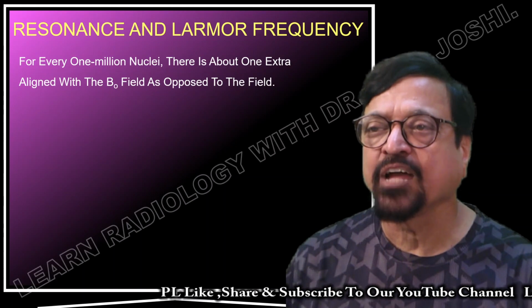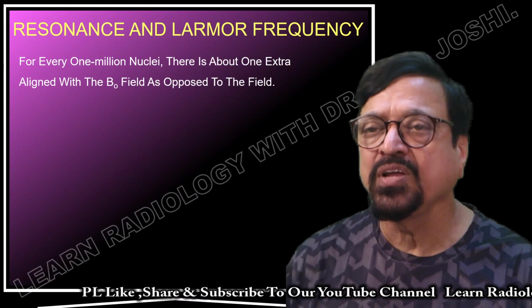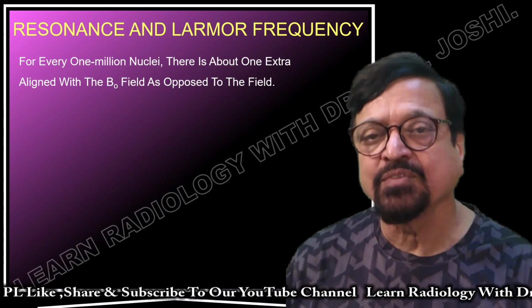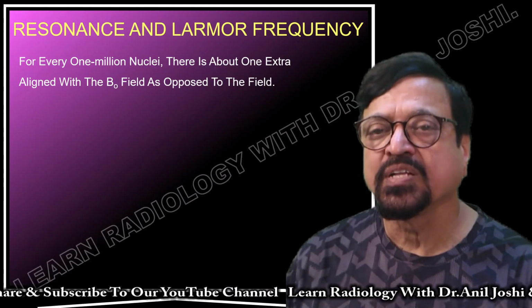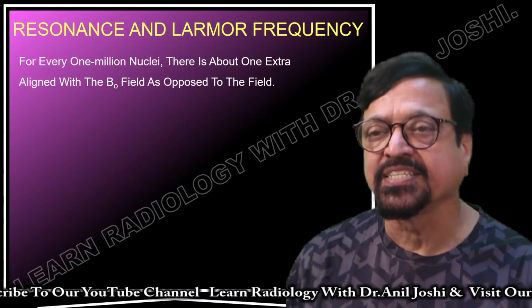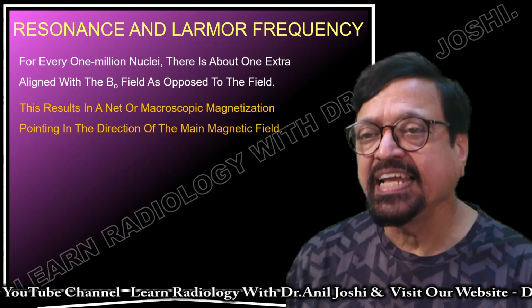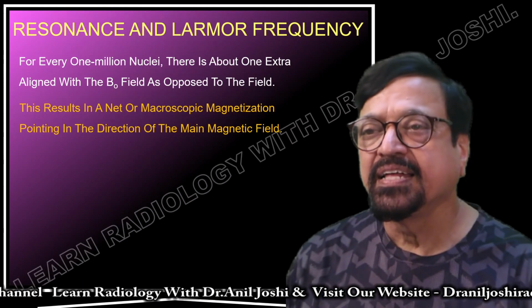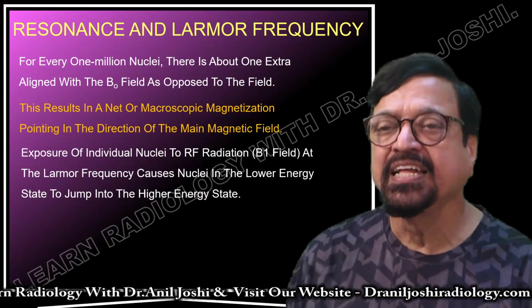Continuing resonance and Larmor frequency, for every 1 million nuclei there is about one extra aligned with B0. Now the B0 axis is the one which has the magnet axis, that is the table axis. So in the resting phase, the B0 axis is the same as the table axis. The resultant is a net or macroscopic magnetization pointing in the direction of the main magnetic field.